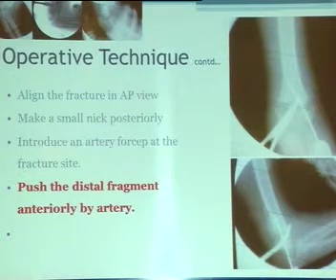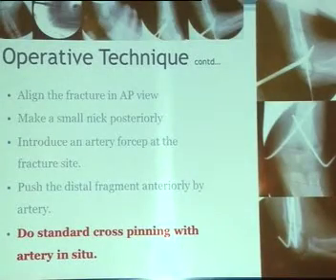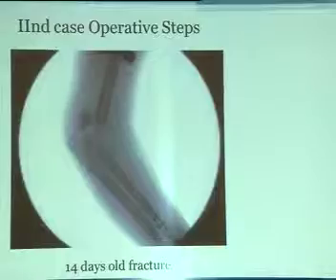If you see now, with this artery in, if you take the Jones view also, you can see AP and lateral, both. In both the views you have a good reduction.